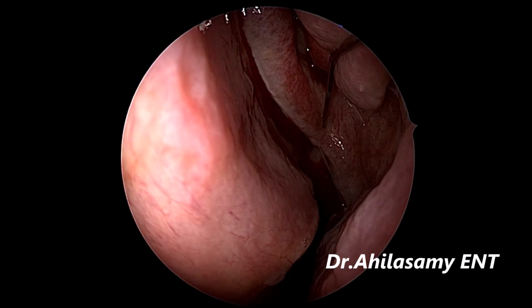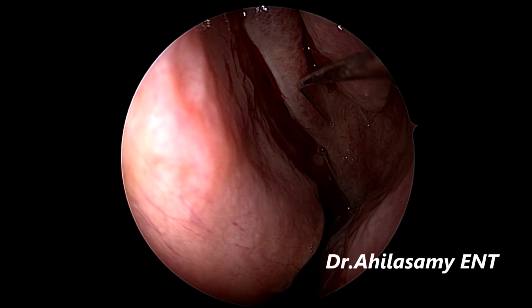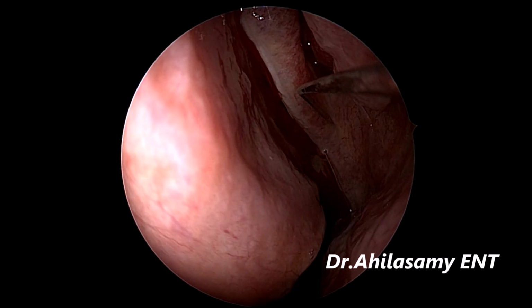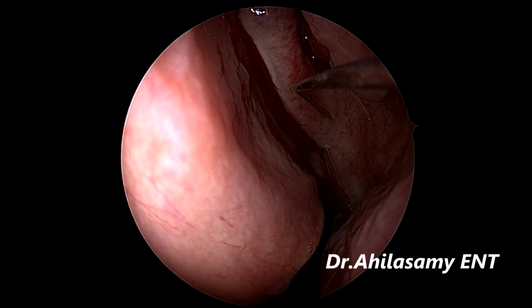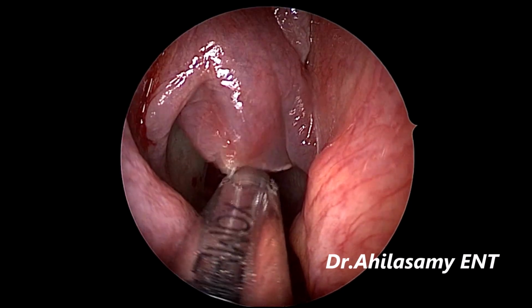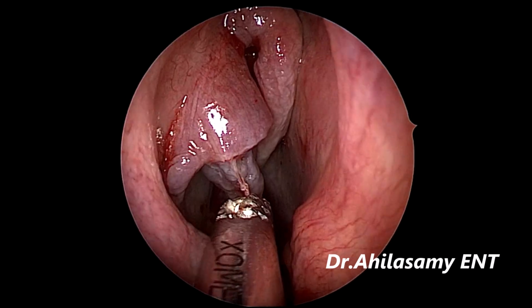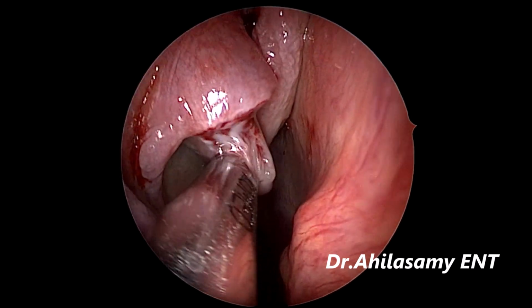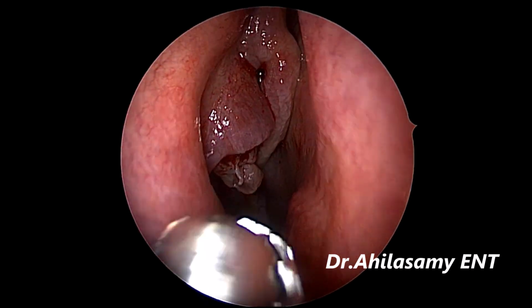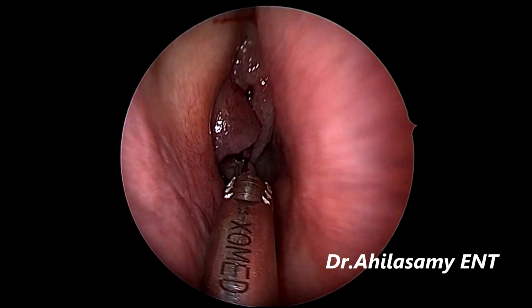In this case, I will be doing FESS on both sides, but I am showing the video here only on the right side. The same steps will be repeated on the left side also. Already this video will be 20 minutes, so I don't want to show the same thing on the left side, even though the surgery is done on both the sides.